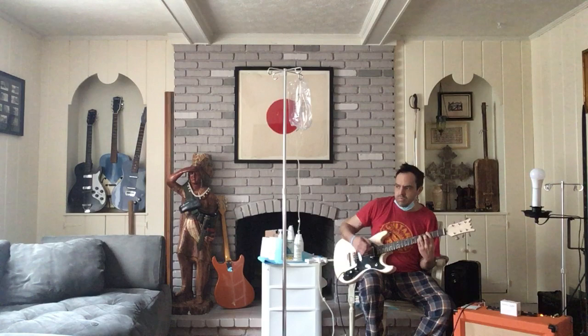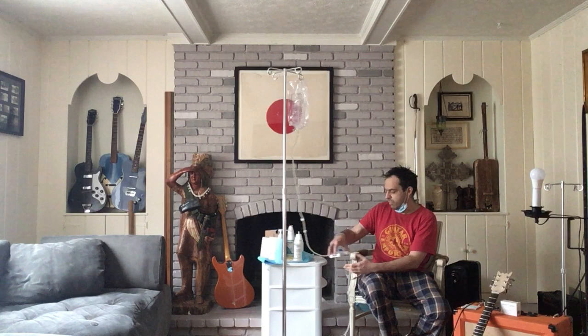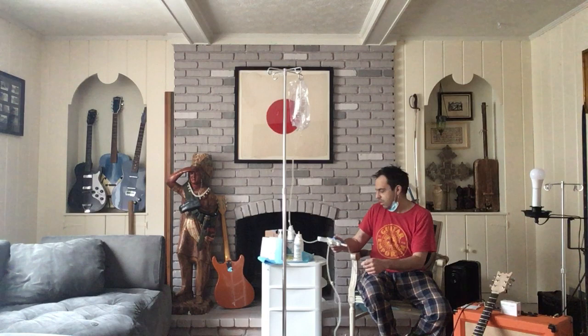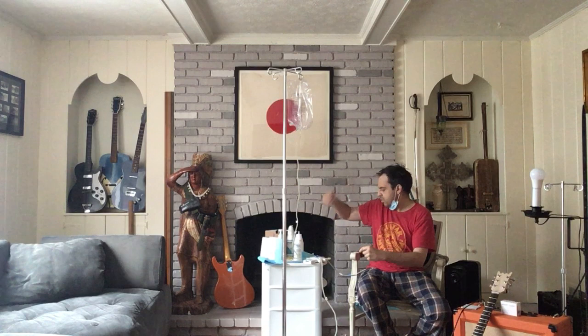Enough of that. We're done with feeling up there. So make it short enough. We have that safety cap from earlier. Okay. Sanitize your hand. Alright. Now, mask on.